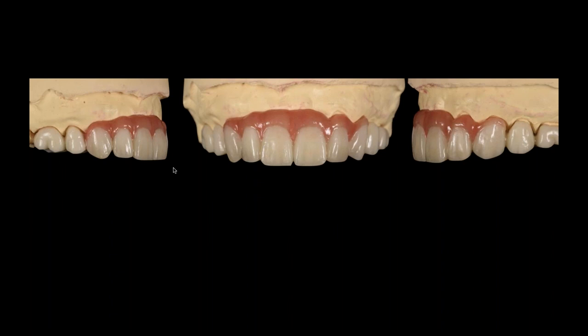I want it to be just a reference point for where the pink needs to be, but I don't want it to match. And the reason I don't want that to be the case is because acrylics and composites optically work very well intraorally to blend into the tissue that's there. Ceramic is not as good. So if I make the first pink, the provisional, match too well, I'm going to have a bigger problem later on. So I purposely make it too light or too dark and just use it as a reference point.